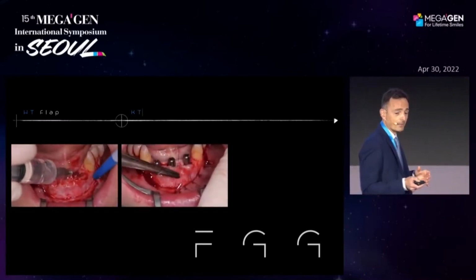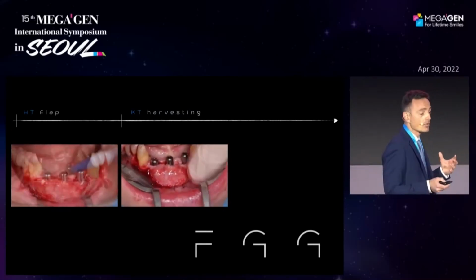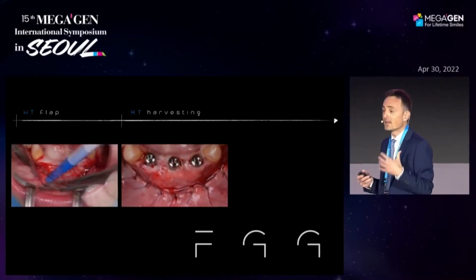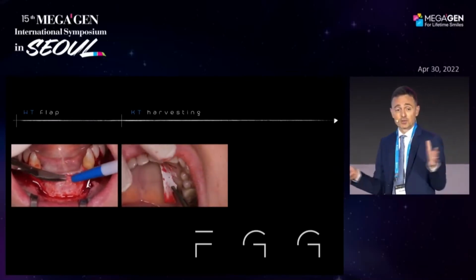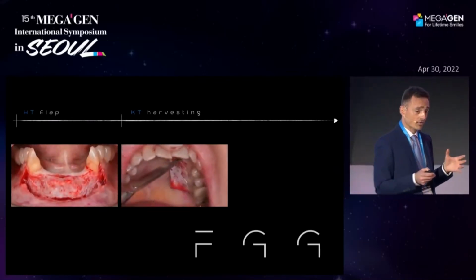And the following step is to stabilize the alveolar mucosa in the fornix. So at the end, you are rebuilding a new fornix, the one that you moved during the first surgery, just to have a primary closure of the wound during the GBR session.